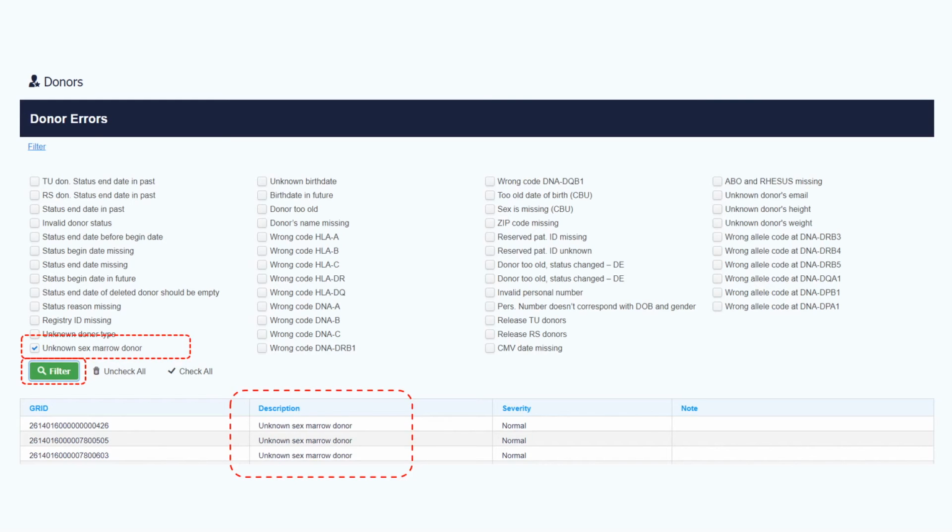That's all regarding the work with donors. We can see that the process is quite intuitive. Also, there are many different validations, including fields validation and validation of working rules showed earlier. Let's take a closer look at the role group module.